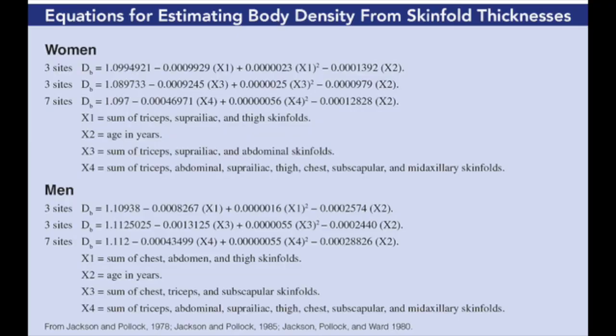Now that we have all the measurements for the skin fold testing, we are going to calculate body fat percentage. For men and women, the body density calculations are different. In order to get body density, you should include the sum of all skin fold sites in these calculations.